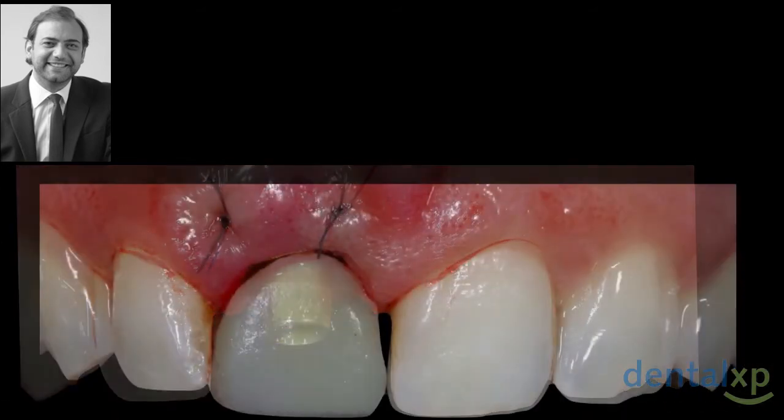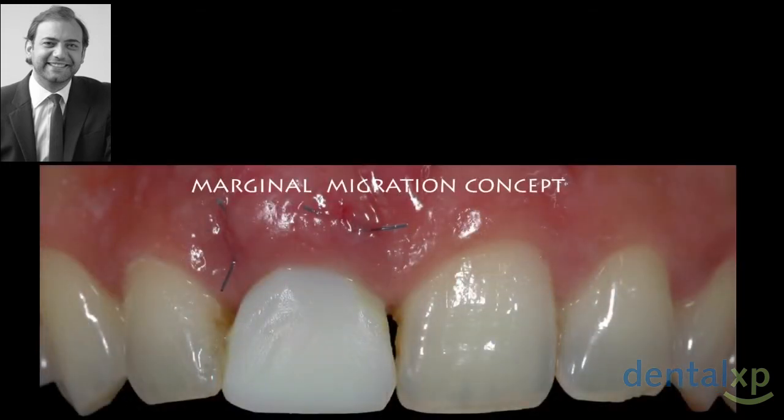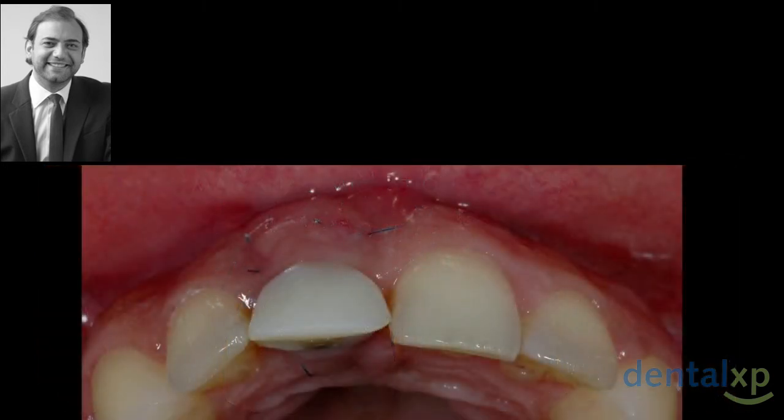This is the clinical situation. The ugly first provisional restoration with a gap in the margin, and this is how it always heals. Not 1 time, not 2 times, always it heals like this. From this picture, you realize that we do not only win soft tissue vertically, but also horizontally. And it's very simple. Why? We extract a tooth with a margin which was here, place an implant more palatally, we mobilized the tissue, and we gave the soft tissue space to grow in.